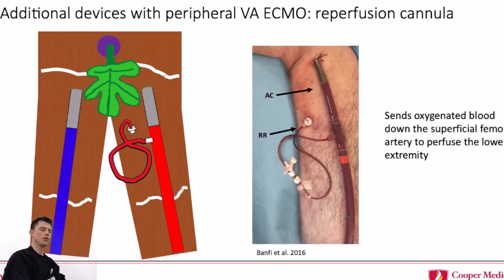Can you add that on? Like, let's say they've already been cannulated for 2 days, can you go back and add one? You can. It's a little more challenging because the blood vessel is now really small, and there's not much blood flow going through, so it's hard to see. So trying to do it up front is probably the better thing. And also, waiting until the foot's ischemic is probably not the right time.